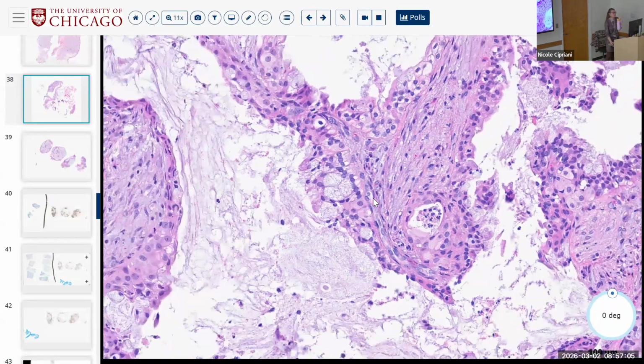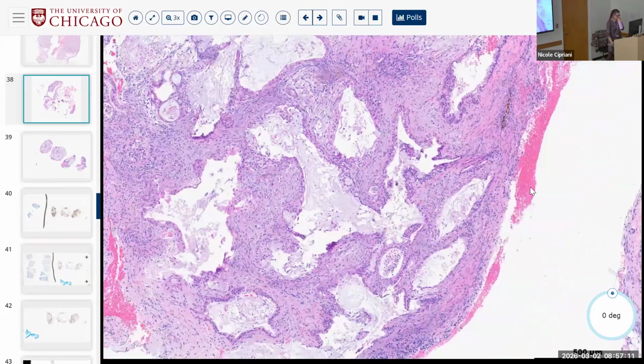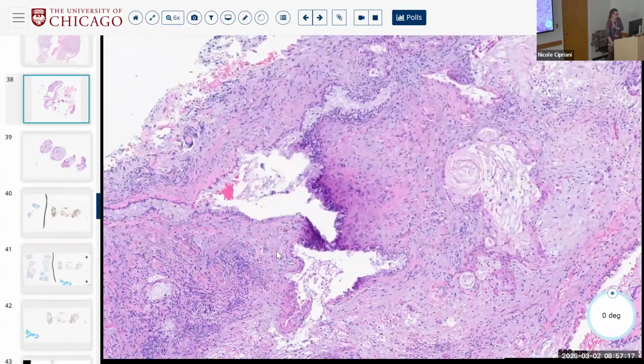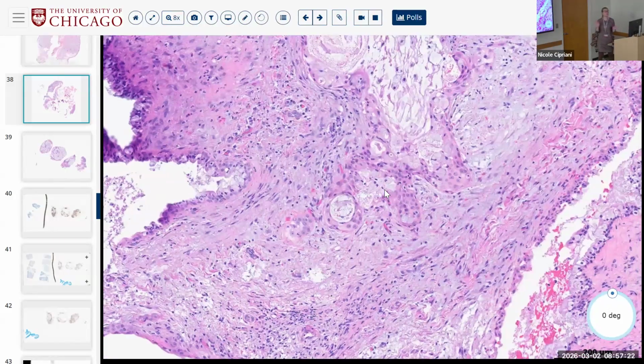Mucoep, right? Top 10 diagnoses here are mucoep. How do we get there? So, cystic, both macro and small microcystic. Remember that mucoep does not have to be cystic, right? It can be solid, but in most cases it's cystic.